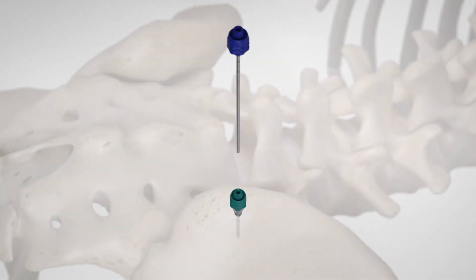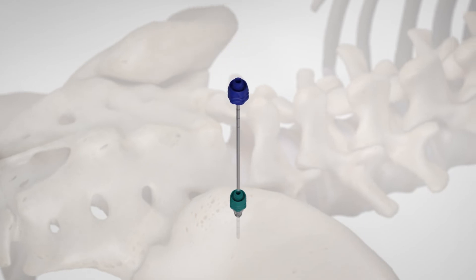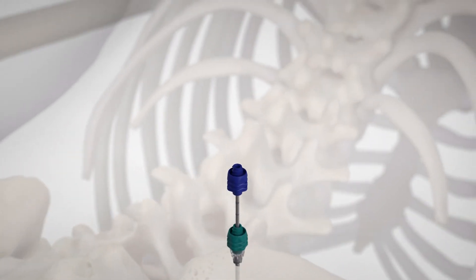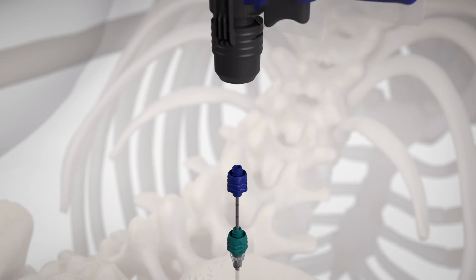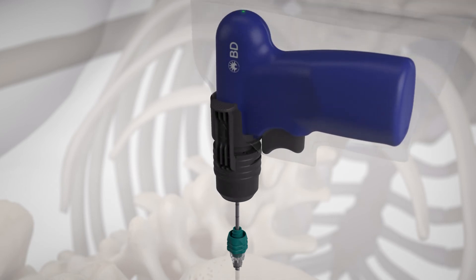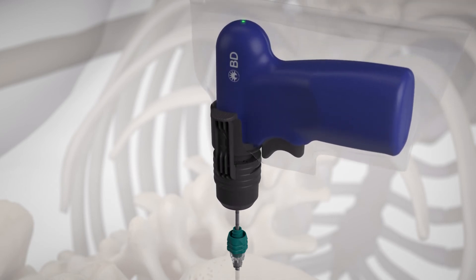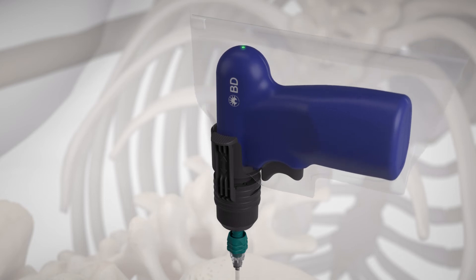For a core biopsy, select the biopsy cannula and insert it into the introducer cannula. Now, attach the power driver to the biopsy cannula, squeezing the trigger to advance the needle to the desired depth to capture a sample.